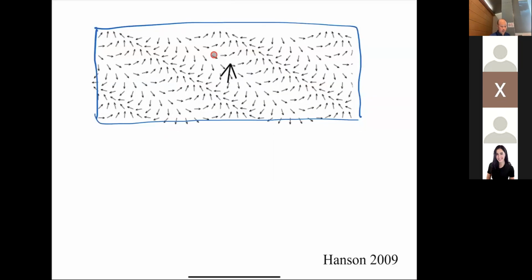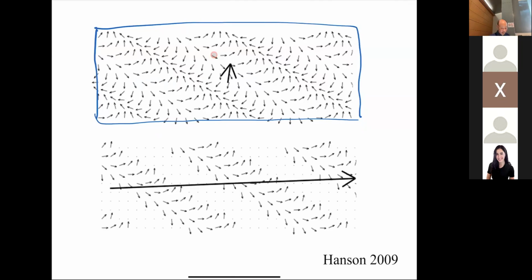All right. This is a square object, and it doesn't really match the stripy pattern very well, right? So that just means that if I look in Fourier space, at that point in k-space, the Fourier coefficient for this bar at a stripy pattern location should be relatively small. But now let's say I take the bar and I just cut out sections of the bar, right? So now the object itself is stripy, right?